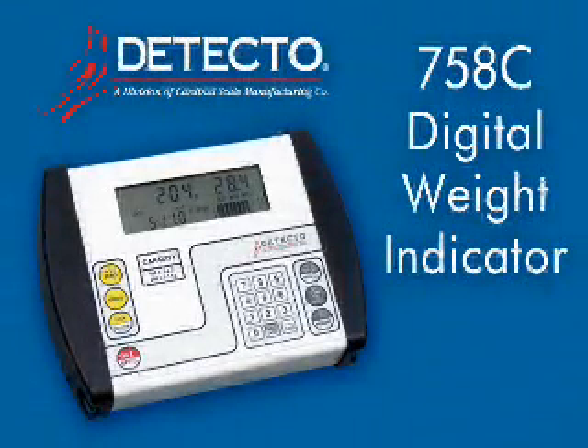Detecto's Digital Healthcare Scales feature the 758C Weight Indicator, a precision, full-featured instrument with selectable units, automatic display lock, push-button keypad tear, selectable key lockout, ID storage, and serial connectivity.